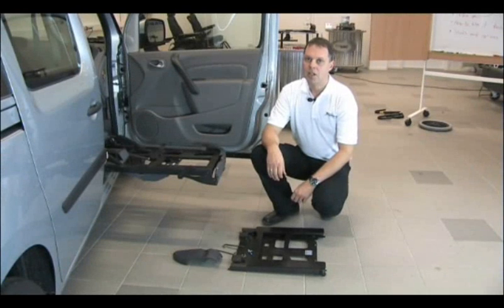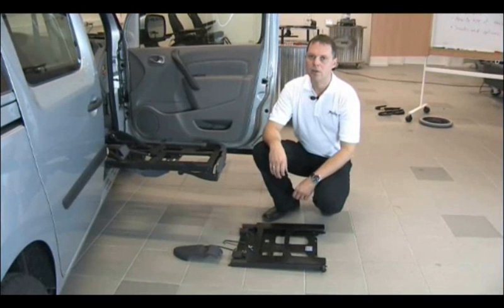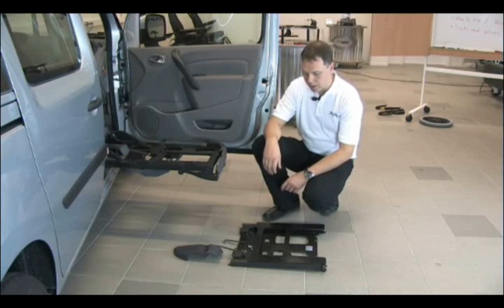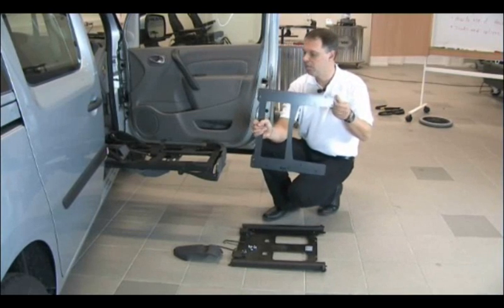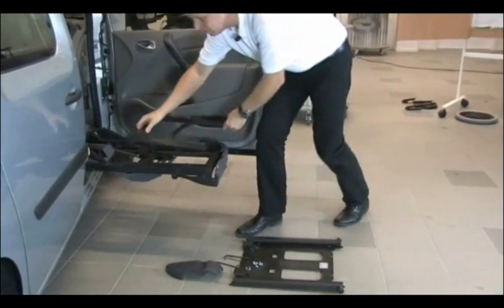When it comes to installation, there are different ways to do it on the Carony Evo and the Turnout. So let's take a look at the Carony Evo. Here we need an adapter bracket. It looks like this, and it's supposed to be bolted directly on top of the Carony Evo.